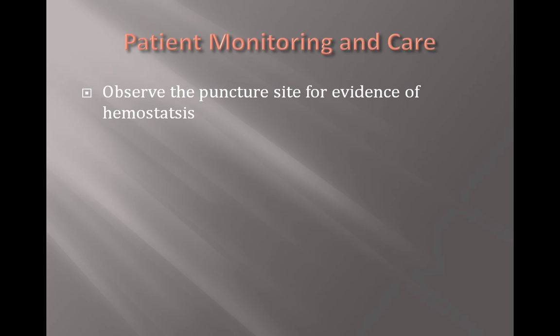I've gotten into the practice of holding pressure until hemostasis has been established. I then prepare my specimen in the room, and before leaving the room I go back and take a look again at the puncture site just to make sure there's no bleeding. I go ahead and send the sample to the lab, and I try to make it a point to return to the patient's bedside just one more time to check on the puncture site. It only takes a couple of minutes, and it really helps to ensure the safety of your patient.